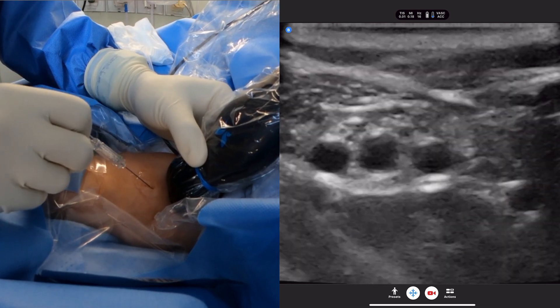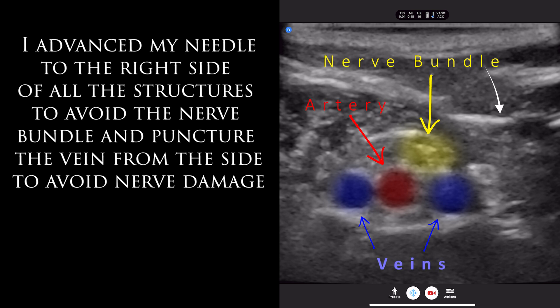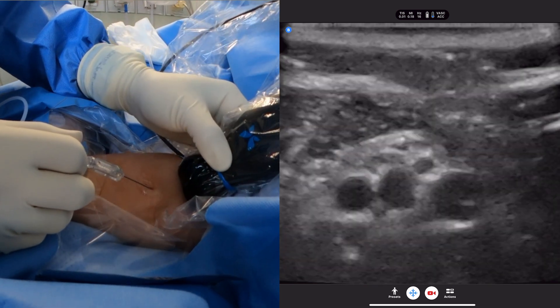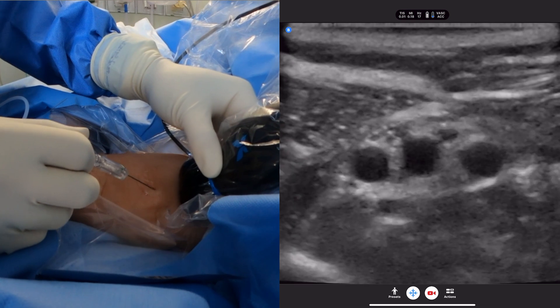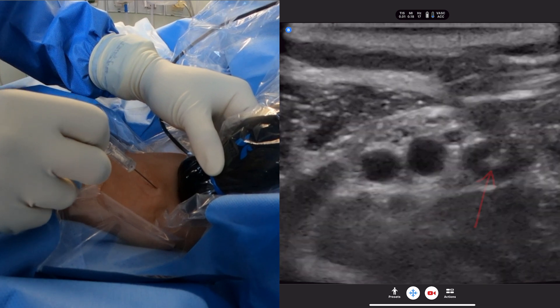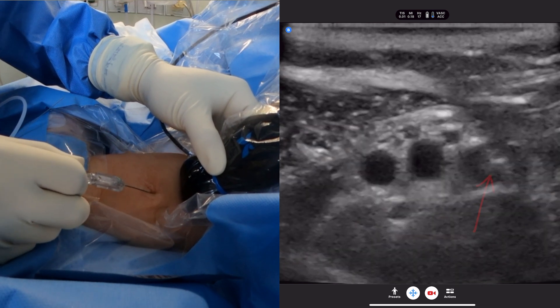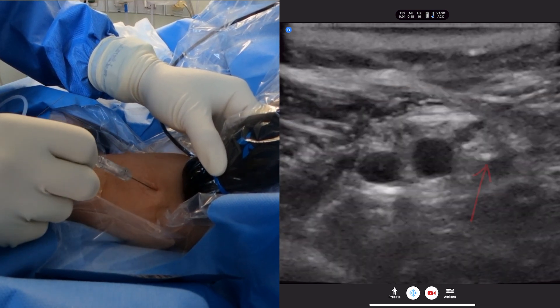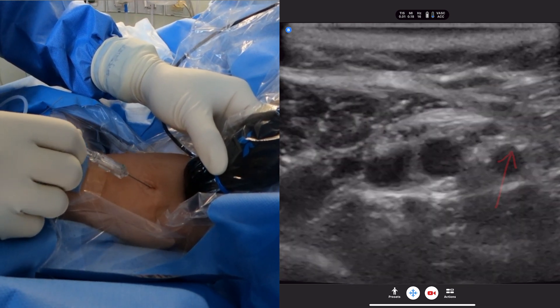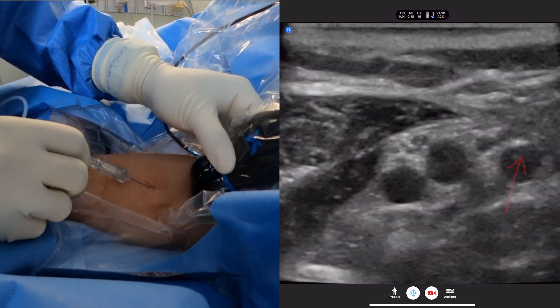Not in my vein. Almost. My vein is also small. This is my needle tip right there. I'm going to advance. Looks like I hit some fascia. I don't think I've punctured the vein yet. I don't see flashback or blood return.